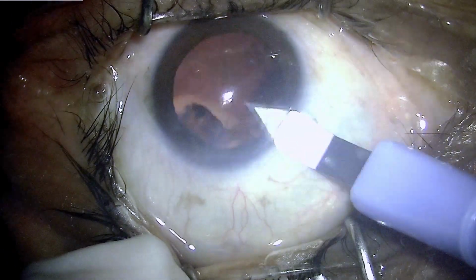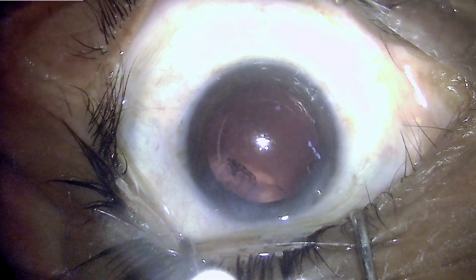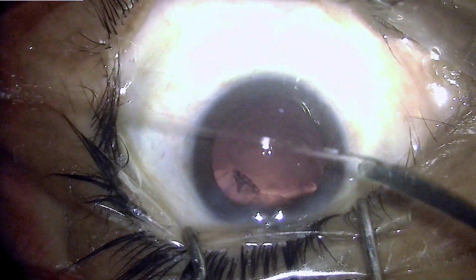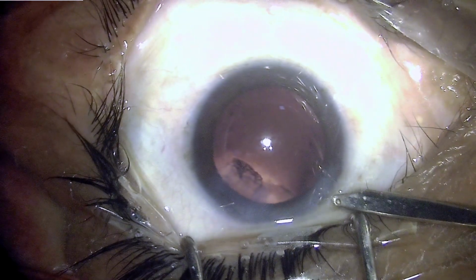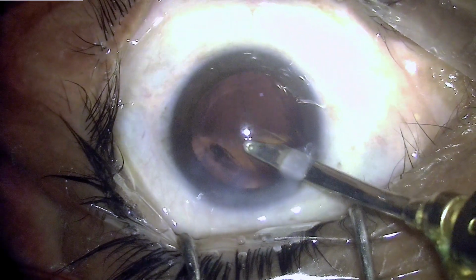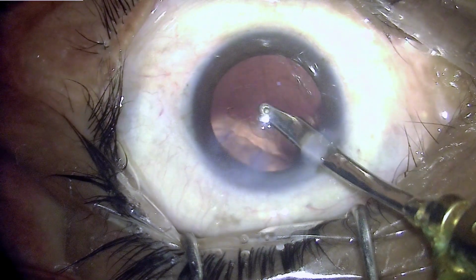So you enlarge the incision just a little bit so as to tightly fit the IA Simcoe cannula, and then one can have a closed chamber situation and remove this chunk of cortex which is hiding underneath the main incision.